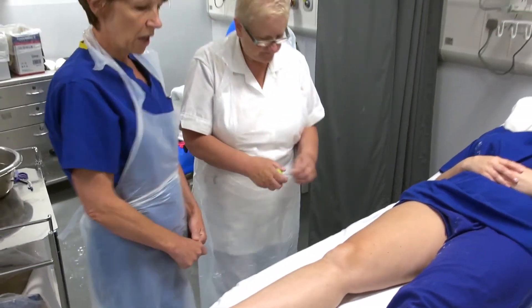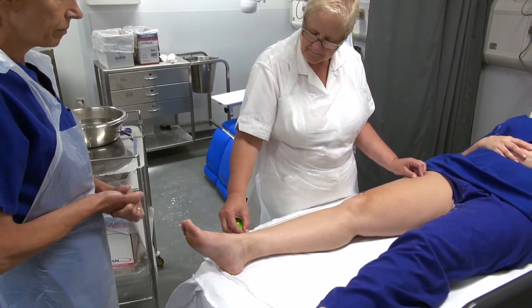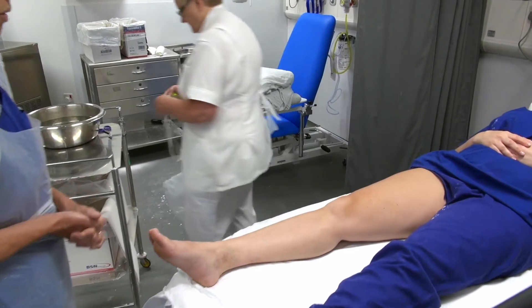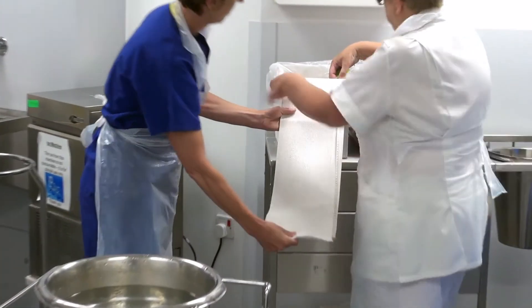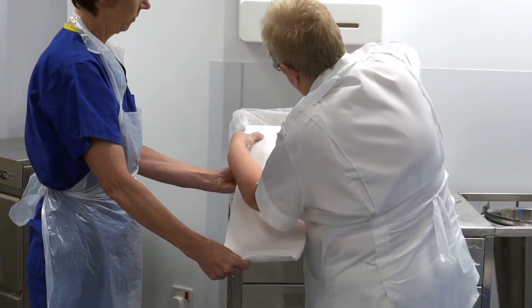Okay, I think we're ready to go. Pam is going to measure first of all the size of the leg. This goes from the top of the thigh to above the ankle. She'll measure her slabs first.